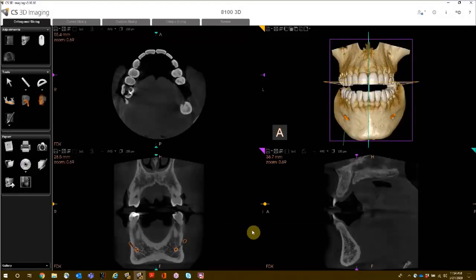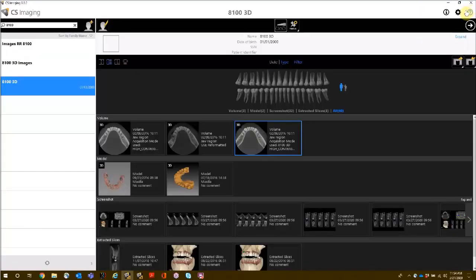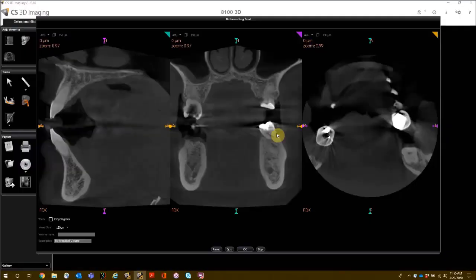Now the reformatting tool will appear each time a volume is opened. For more information on Preferences, see the recorded class for Setting Preferences. The reformatting tool allows you to make the volume smaller, change the resolution, or correct patient positioning.